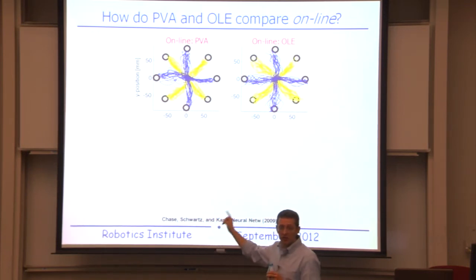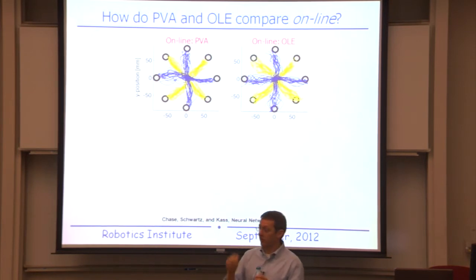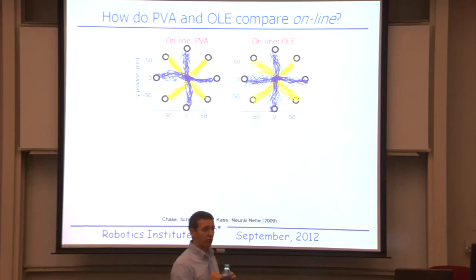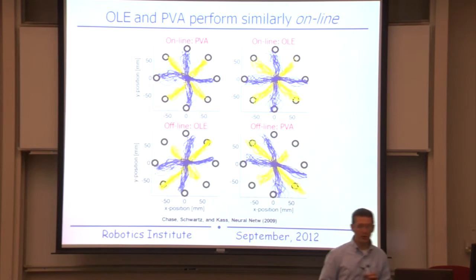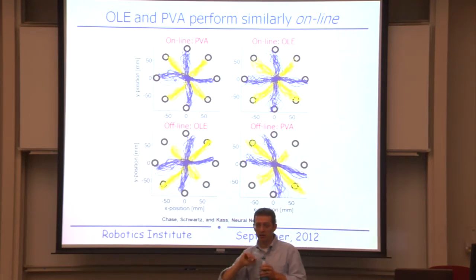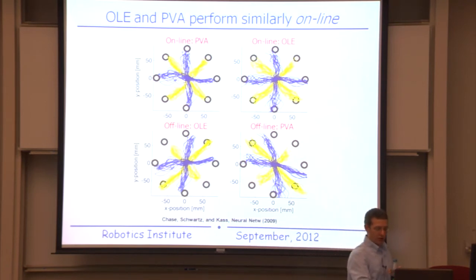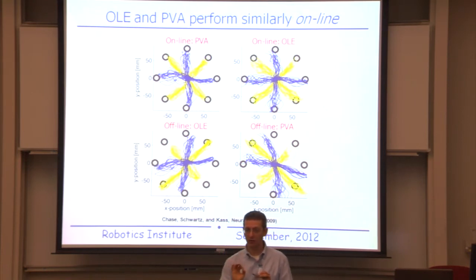And just looking at these, you'd be hard-pressed to tell me which was the biased decoder and which was the unbiased decoder. So it could be that for this particular sample of neurons we had, it didn't happen to have a lot of bias in it. Maybe the preferred directions were nicely uniformly distributed or something like that. It turns out that's not the case. And to show that, we can take the same firing rates when the monkey is using the population vector algorithm, and we can decode them offline using the optimal linear estimator. And what you get are the trajectories shown here, which show those characteristic biased curves. Most of those trajectories are missing the targets in characteristic directions.